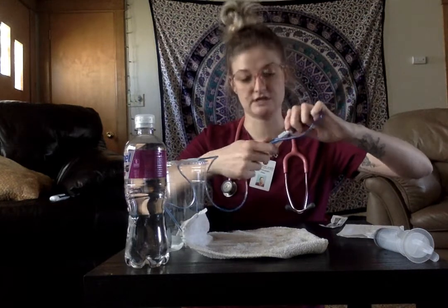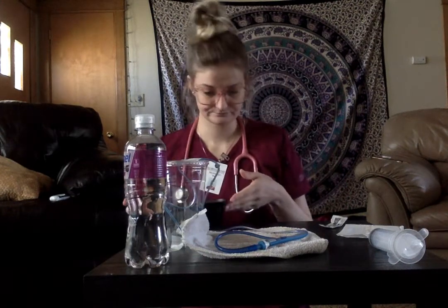And so during this, you also want to just loosely secure it again to their face so it doesn't move. And then you also want to check placement of this. You can also do this with a chest x-ray, preferably, what normal doctors would prefer. And then you want to aspirate 20 milliliters of gastric juices and then place it in a pH reader, where it should be 1 to 4 to indicate gastric juices. And if it's not, you would want to take it out because it's not in the right place.